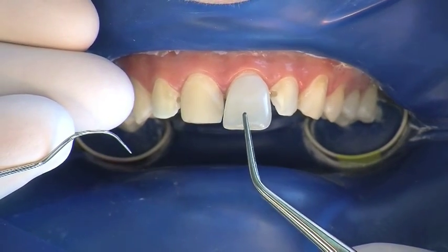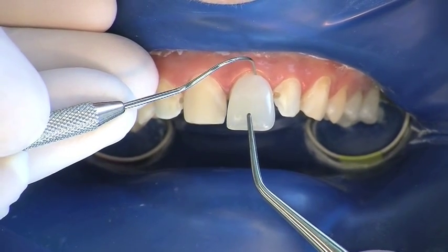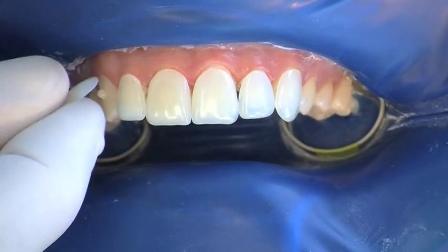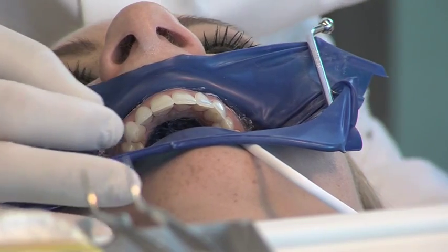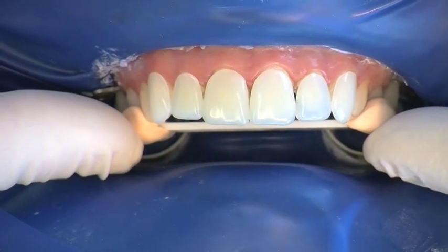Corrections of shape for cervical contour and incisal length can be checked directly on the tooth. The corrected Componeers can also be placed on the teeth using a small portion of composite, making it possible to check the future occlusal plane.